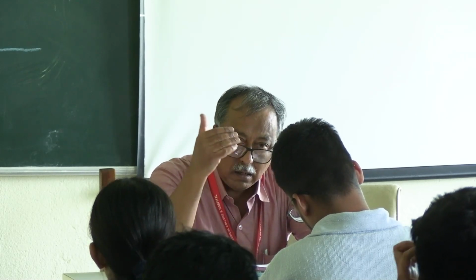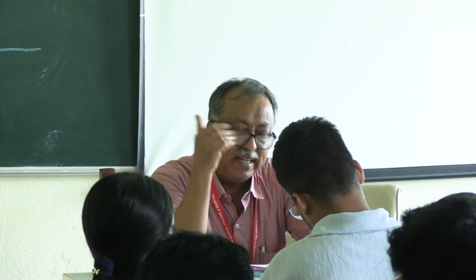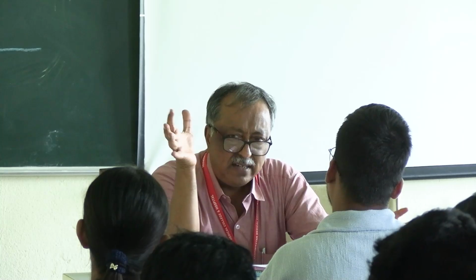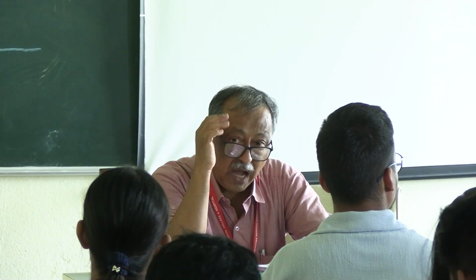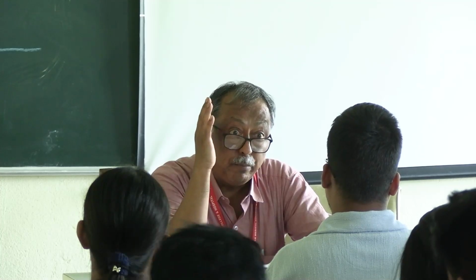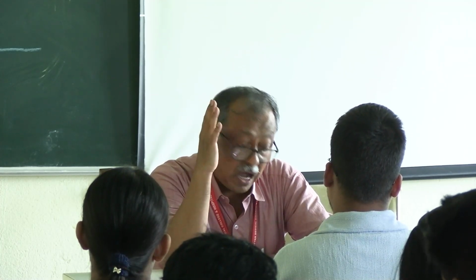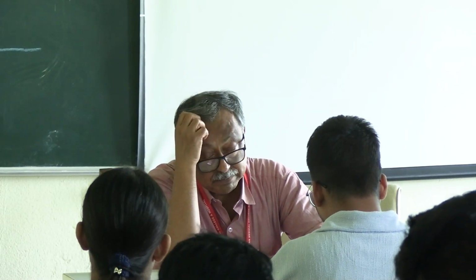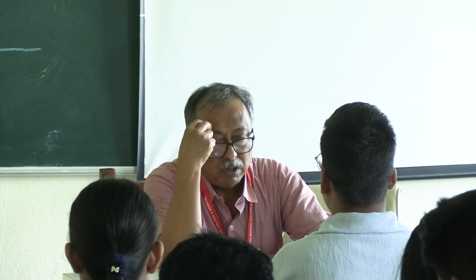And you will directly see the ear which should be examined. Generally a quiet situation is needed and the eyes are closed, otherwise there is the possibility of lip reading. So the patient's eyes are closed, and we use spondee words. Spondee words means two-syllable words.